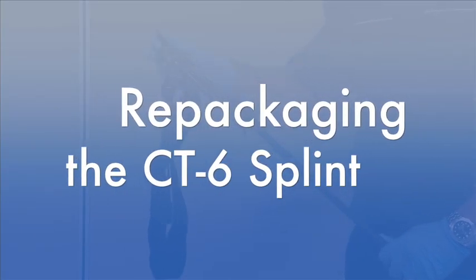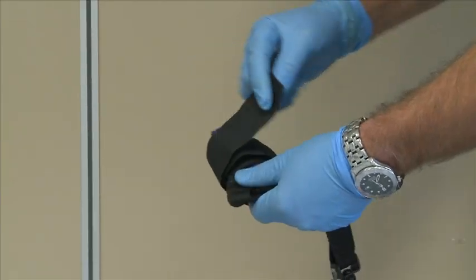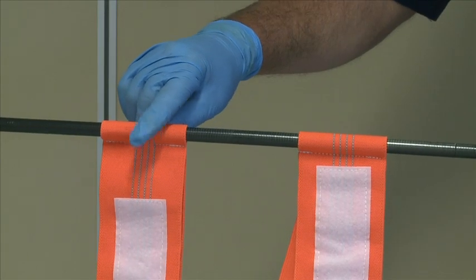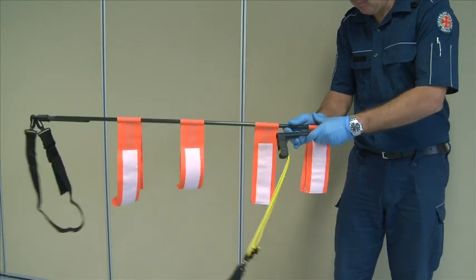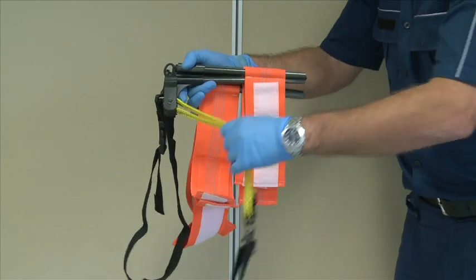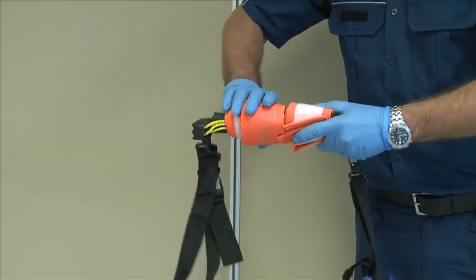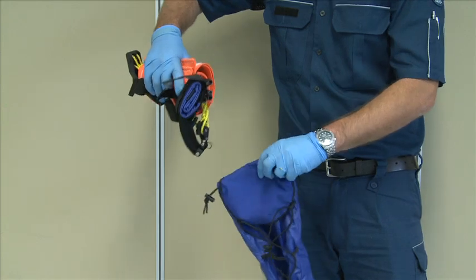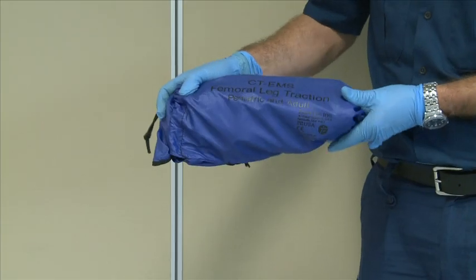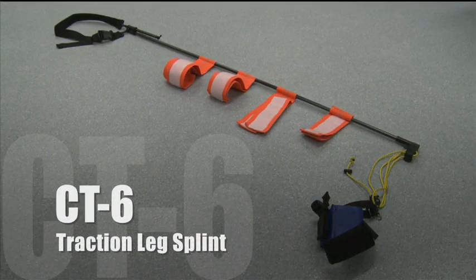Repackaging the CT6: reattach the ischial strap to the splint, re-roll the ankle strap and secure it with velcro. Ensure the straps are straight and none are hanging over the connected segments. Pull each segment and fold it back on top of itself until you have a tight bundle. Pull the ankle hitch through the unit and roll it — best results are achieved when the straps are stacked in pairs and the ankle hitch is free of the roll. Place the CT6 back into the bag, ankle hitch side first for easy deployment. Make sure you get your hands on one and have a practice prior to deployment.